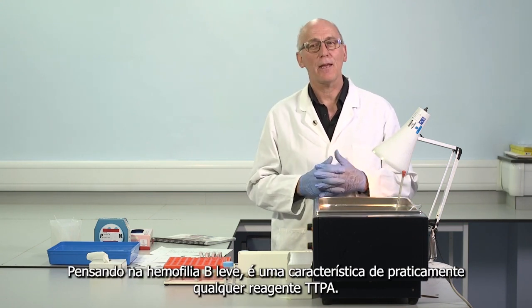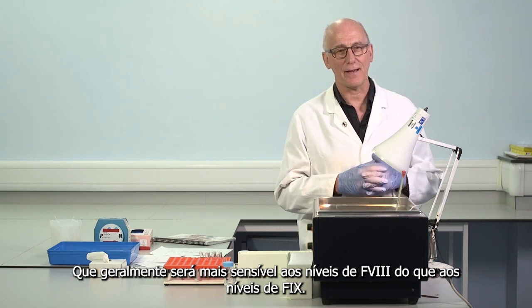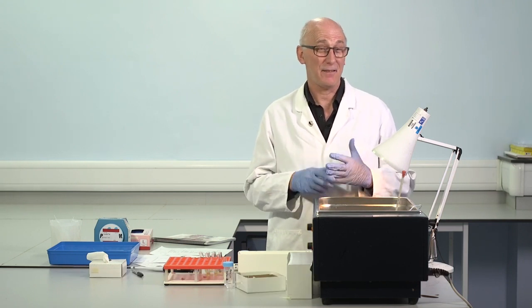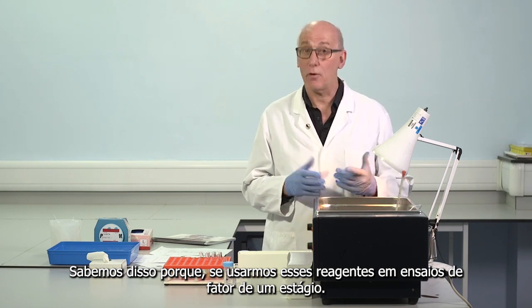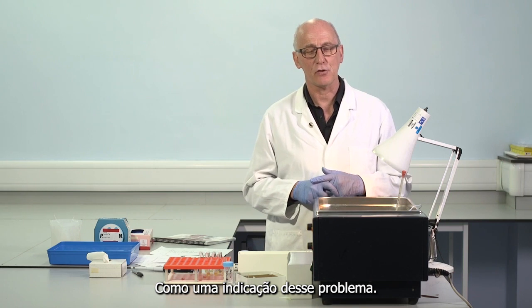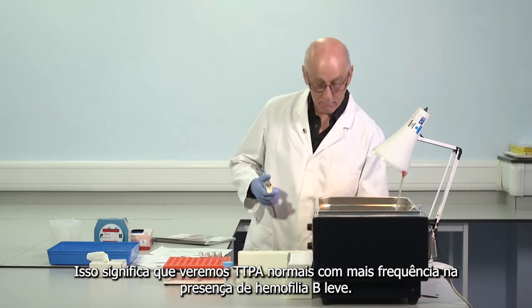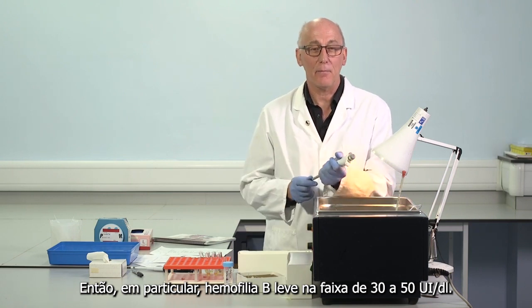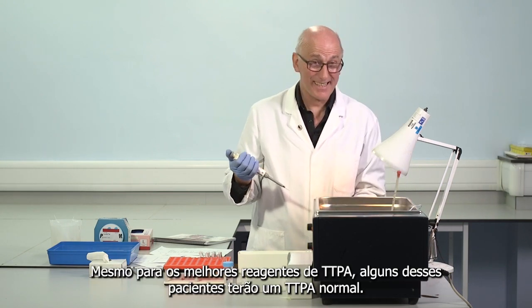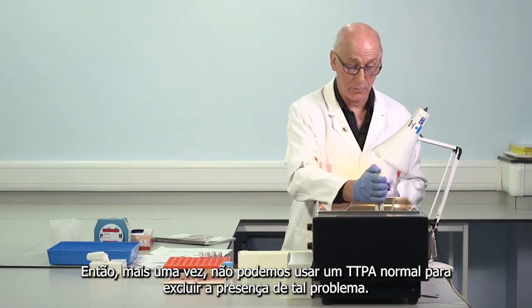Thinking about mild haemophilia B, it's a feature of pretty well any APTT reagent that it will usually be more sensitive to levels of factor VIII than to levels of factor IX. We know this because if we use those reagents in one-stage factor assays, we can draw some conclusions from the dose-response curve, and they're almost always a steeper slope for one-stage factor VIII than for one-stage factor IX, as an indication of this issue. It means that we will more frequently see normal APTTs in the presence of mild haemophilia B, in particular mild haemophilia B in the 30 to 40 to 50 units per deciliter range. For even the very best APTT reagents, some of those patients will have a normal APTT. So once again, we can't use a normal APTT to exclude the presence of such a problem.